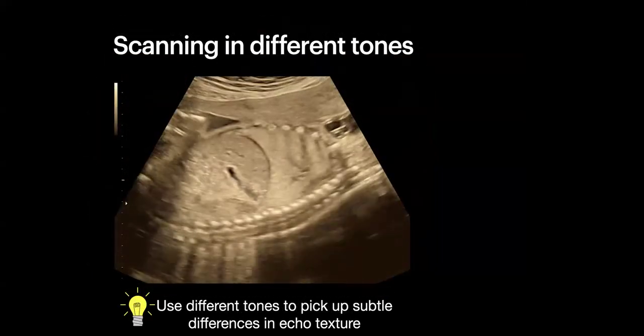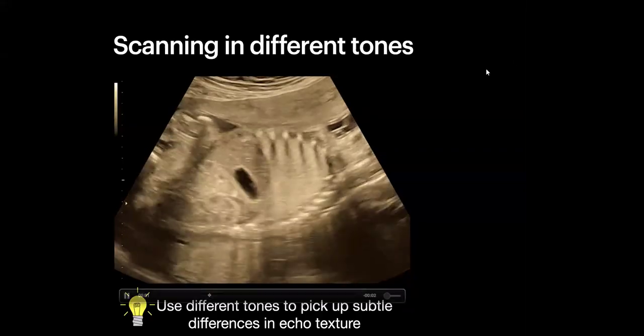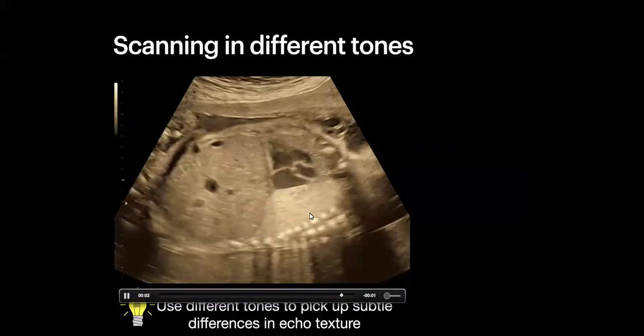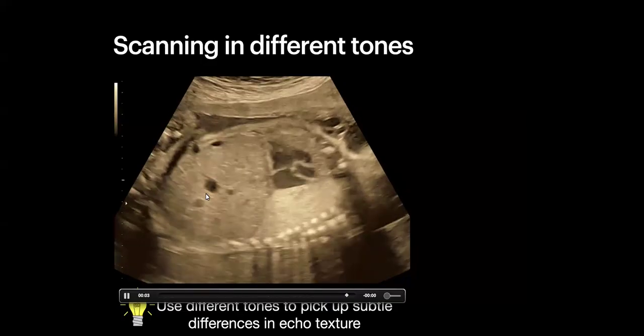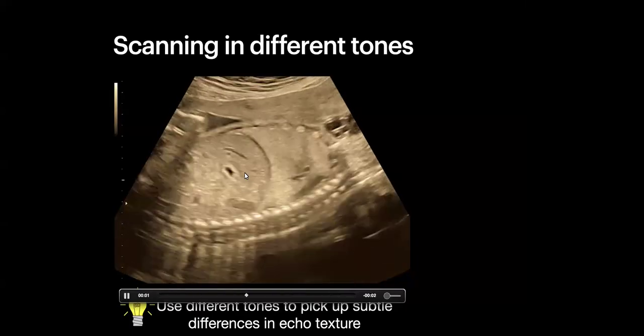Also, this is just showing an example of a sweep going through the diaphragm. And again, you could appreciate the echo texture just by using this different color map. You could appreciate the lungs. You could actually appreciate the diaphragm demarcation that you could see here, as well as bowel. So really give it a try and let me know what you think.